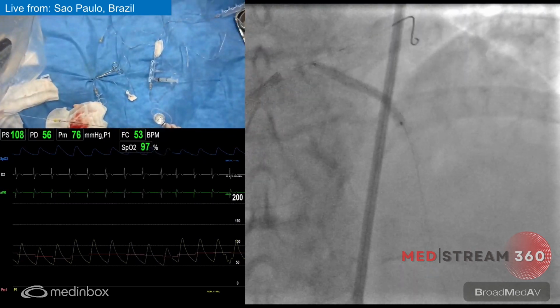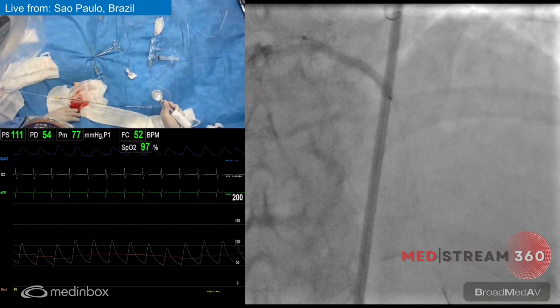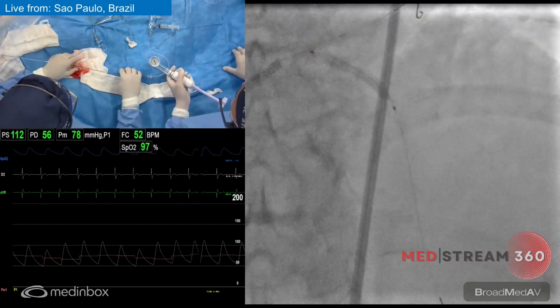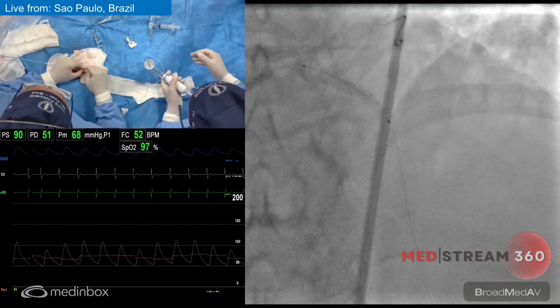And what pressure do you want to go here, Rodolfo? 6. So it's 7. It's 1 by 1, right? Yeah. So okay, you don't feel you need to be more aggressive to deploy the stent. There's a good lesion preparation. That's why lesion preparation was important.